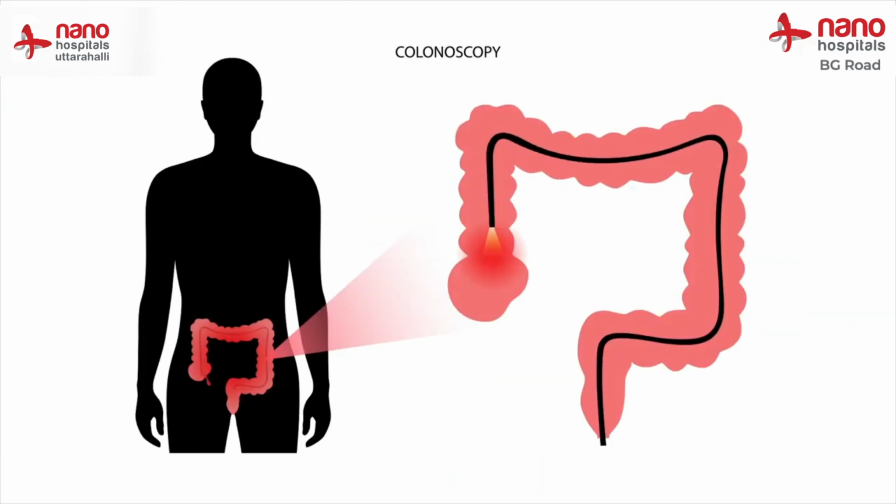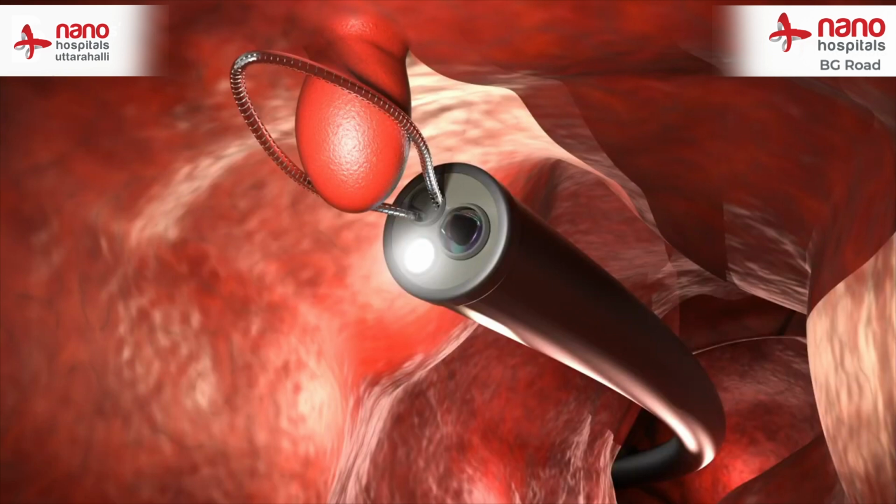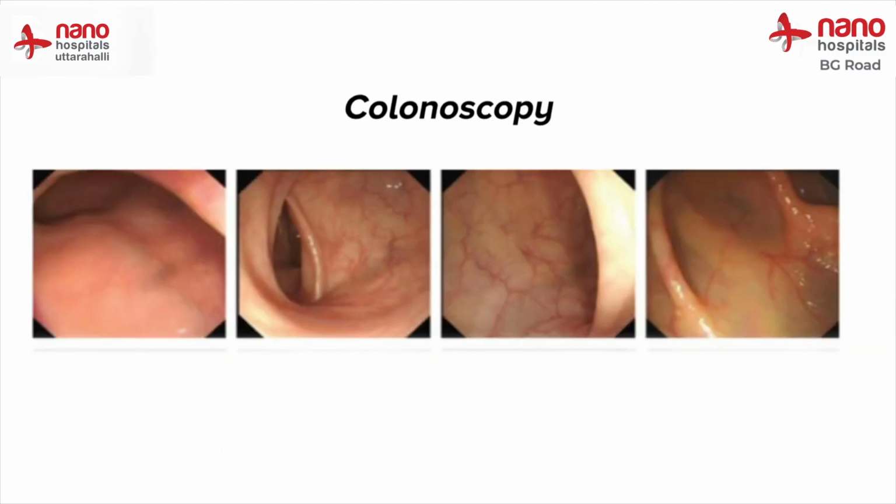Coming to the colonoscopy, the camera is introduced through the anal canal and as the camera advances the intestine is filled up with air. Due to this the patient will experience some amount of bloating sensation of the abdominal cavity and during the passage of the scope through the intestine, at a couple of places there could be some pain. So generally the colonoscopy is done under sedation so that the discomfort is minimized. Even in colonoscopy, if any abnormality is found, we might take a biopsy to send to the lab for testing. If there is no abnormality, photos will be taken and the camera is brought out of the intestine. So this is in brief about what is done and what you should expect during an endoscopy.